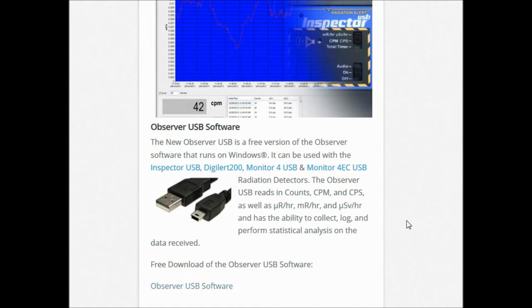You'll notice a little balloon pop up in your system tray letting you know that the USB is running. Once you have that installed, turn on your unit, wait for it to finish the power cycle, and then plug in the USB into the side.